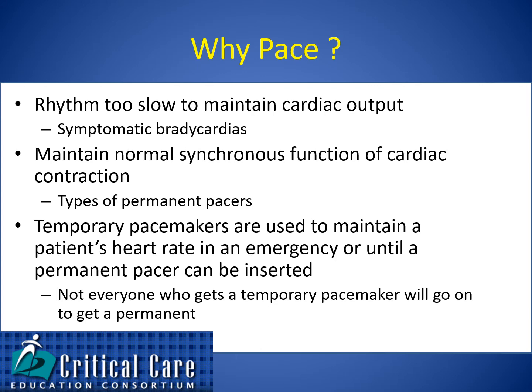So why do we pace? It is usually due to a bradycardia, a symptomatic bradycardia. If your heart rate is too slow, heart rate times stroke volume will decrease, causing a decreased cardiac output. We also need to maintain synchronous function of the cardiac contraction, usually with different types of permanent pacers.